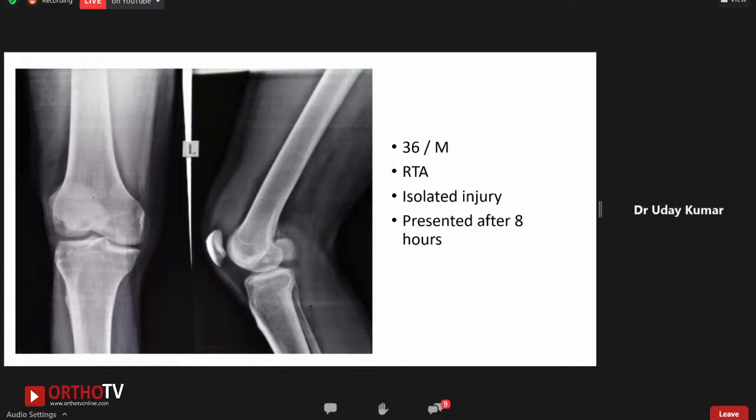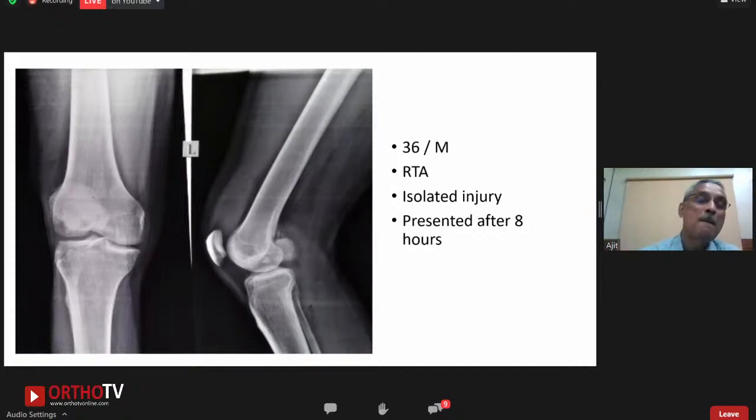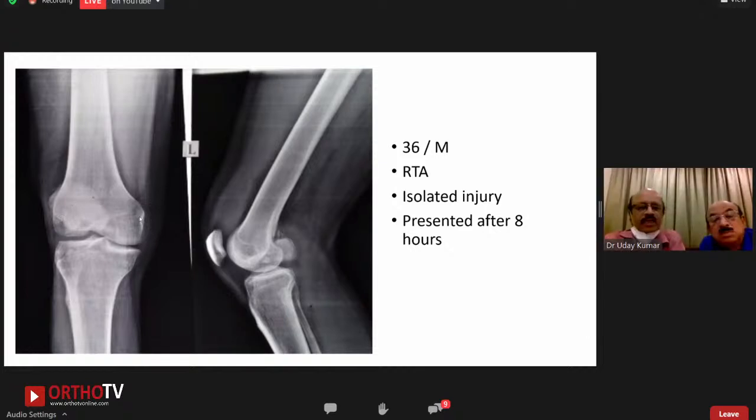Well, looks like a posterior condyle, posteromedial part of the femoral condyle. So most likely a Hoffa type of fracture. Can you hear me, Ajit? Yes, I can hear you. Dr. Rajiv wants to say something. Isolated posterior condyle fracture. It actually looks like a posterolateral one from the lateral side. There seems to be a posterolateral Hoffa fracture.